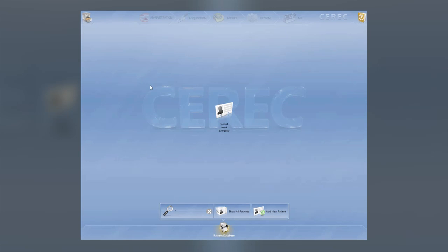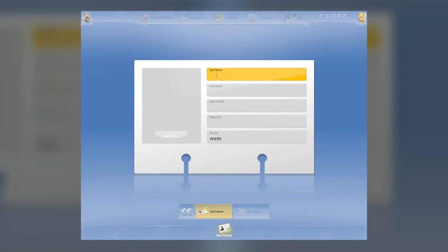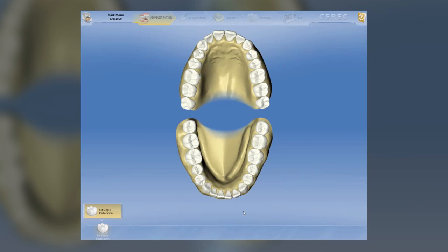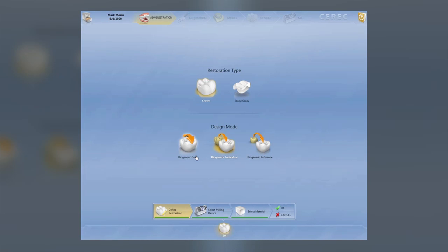We're going to do a crown at number 30. You can see that the screens are all different — this is what we're going to show you. We're going to add a new patient now; you have all different windows here. We're going to call it Mark Morin and go forward. Now we're going to pick out the tooth — a crown at number 30. You'll see that we have our choice: two types of restorations, a crown or an inlay/onlay. This is going to be a full crown. We have a design mode with three levels: biogeneric copy, biogeneric individual, and biogeneric reference. My preference is biogeneric individual — I think it's incredible. So we're going to hit that one.